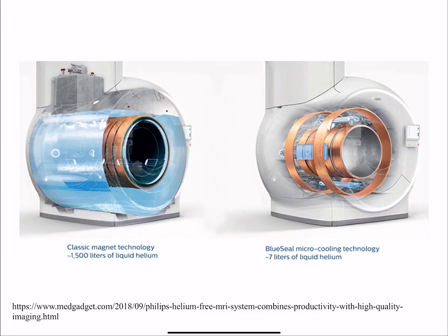So what we talked about is that in classic technology, we need a lot of liquid helium. And that is a problem because there are sometimes worldwide shortages of liquid helium. It's a limited resource. And so there is a move to find how you can do MRI with less liquid helium.